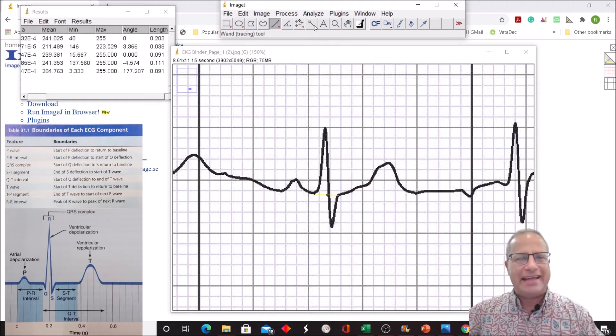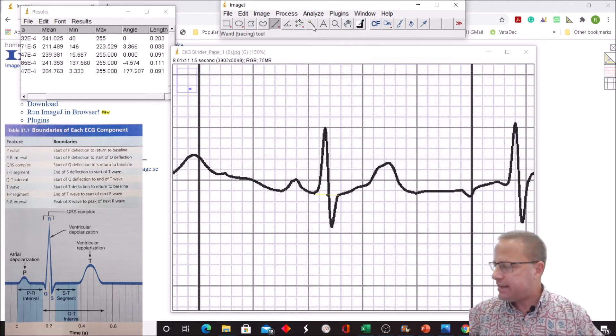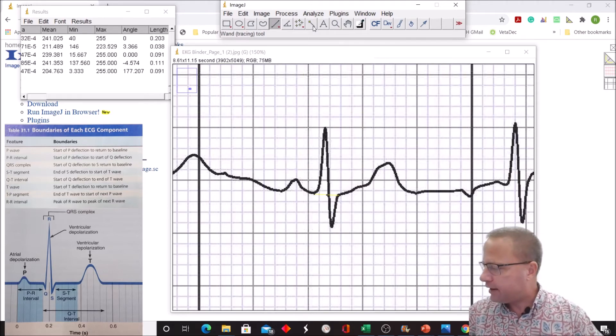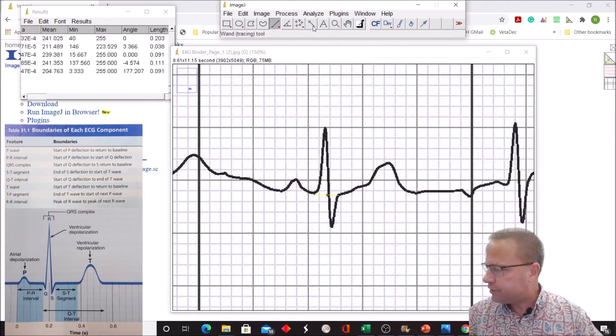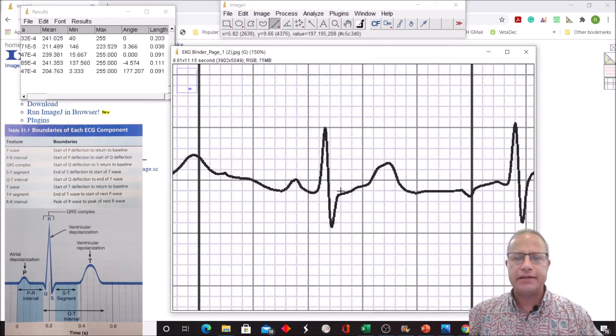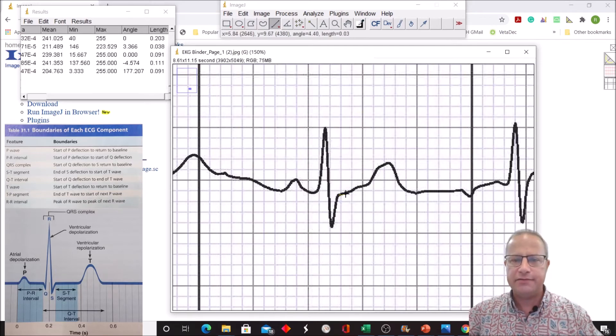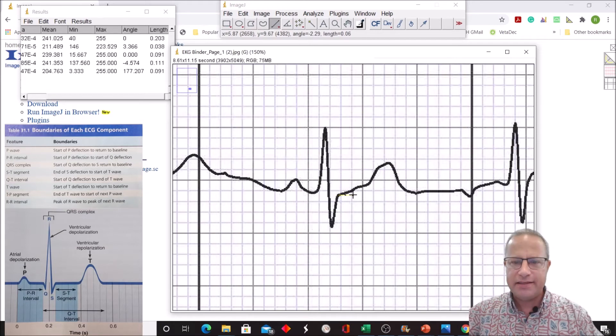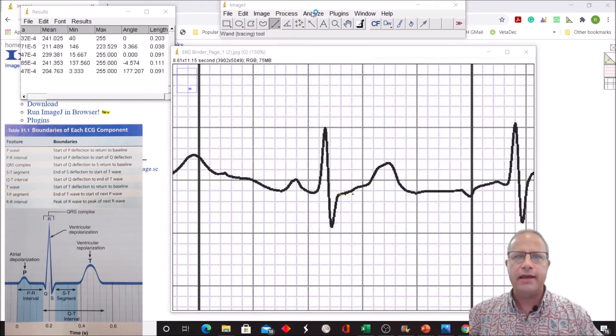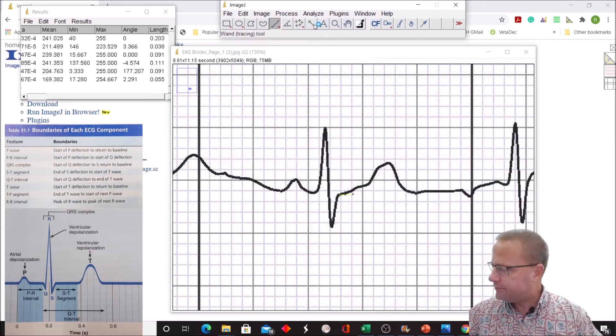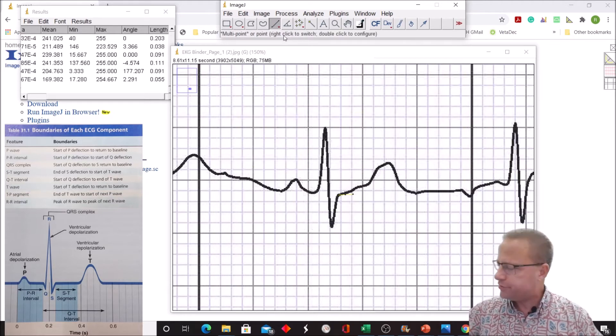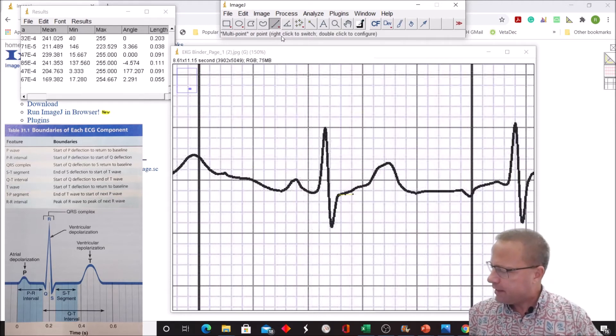Now we're going to measure something called the ST-segment. The ST-segment is the end of S-deflection to the start of the T-wave. Segments do not contain the waves. This was Q, R, S, end of S to beginning of T. The T kind of gradually slopes up, so I say it's going to begin right about there. Analyze, measure, comes out to be 0.055. We see that the range there is less than 0.2, so we're doing good there.